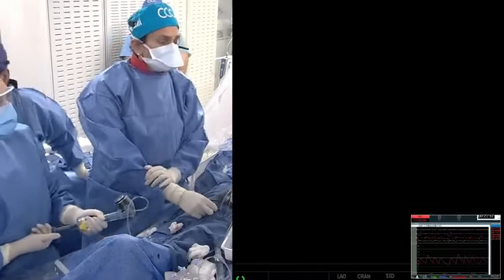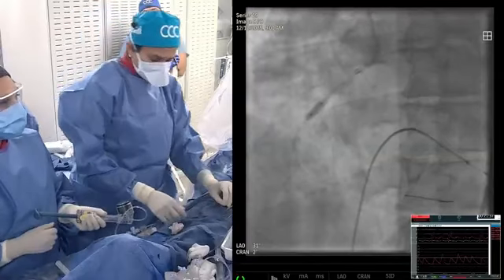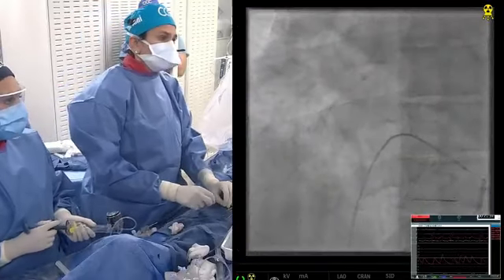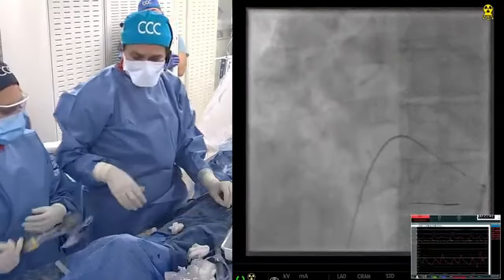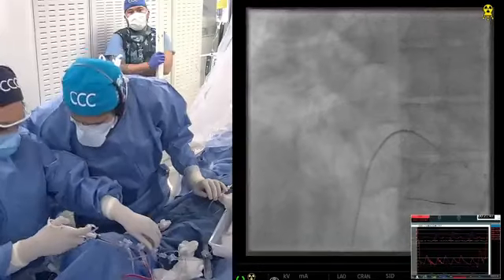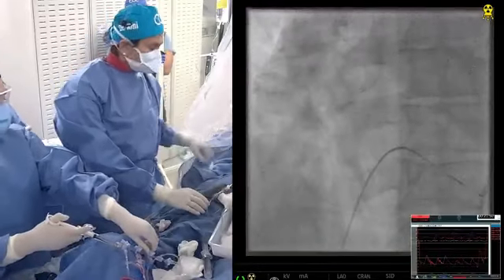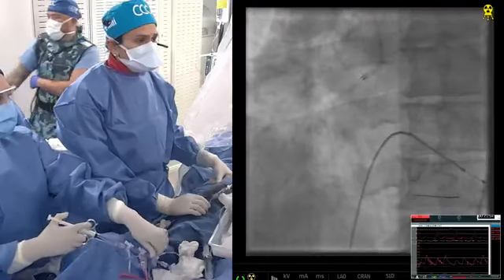Now, I do not go to 20 or 22 because the COPS trial had a 4% perforation rate in the cutting balloon group. Why? Because their average pressure was 22. I know we talked to Colombo, but Colombo still wants to go to 22 atmospheres. To me, no. Give some vasodilator before you take a picture. Look at the ST elevation. Go.